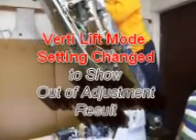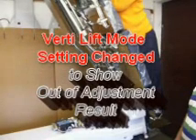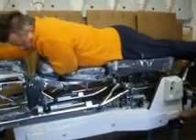Alright, so in this case, what we have done is we've restored the Hylo setting on the valve pack to a factory setting, and we have upset the VertiLift setting on the valve pack so that we can clearly see what the effect is. The effect in this case will be that the table will come down in Hylo mode and then move to its preset height in VertiLift mode correctly, because the factory setting in Hylo mode is correct.